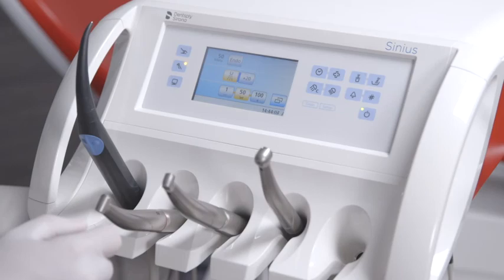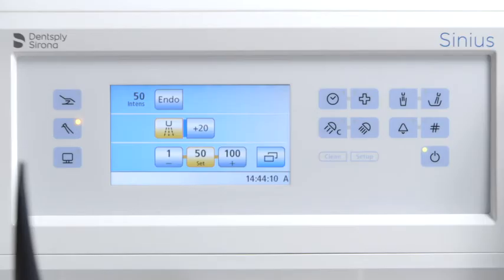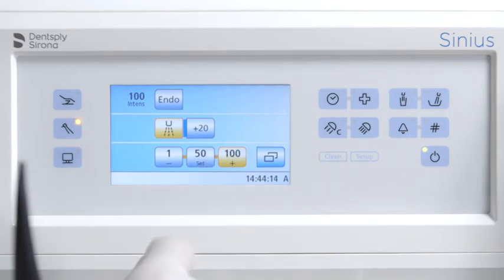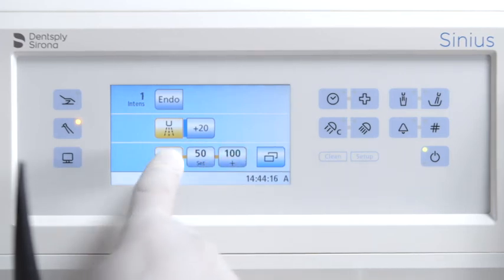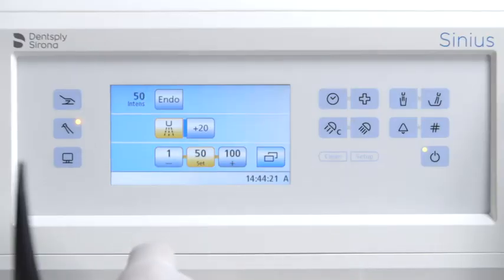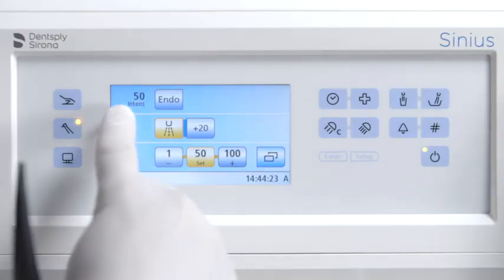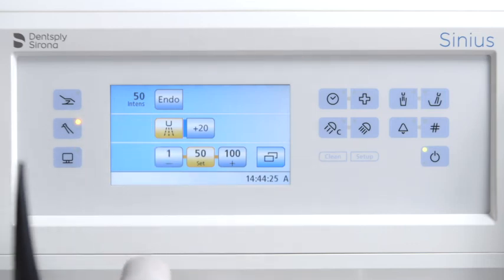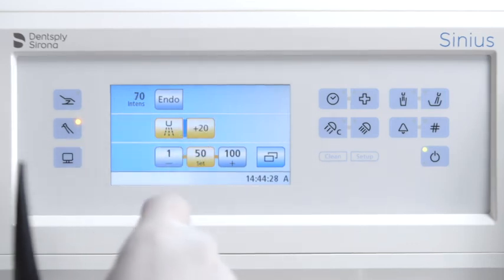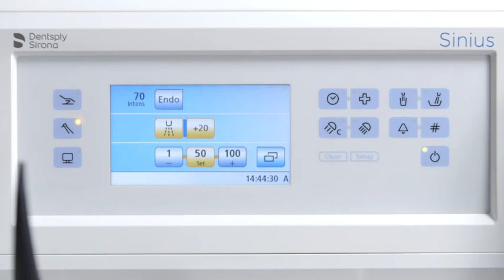To select the intensity using the quick setting keys, remove the serosonic from the holder. Touch one of the quick setting keys in the bottom line briefly — the quick setting key is highlighted orange and the selected intensity percentage is displayed in the first line. The boost function increases the intensity of the serosonic TL ultrasonic handpiece during treatment in increments of 20 in reference to the final value.